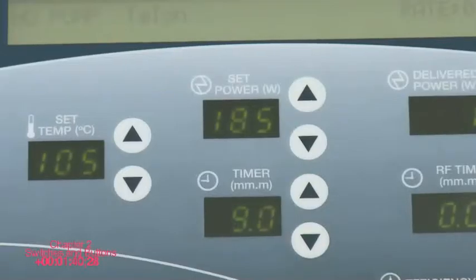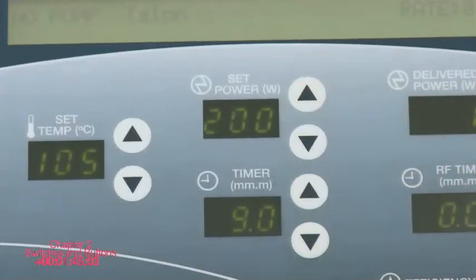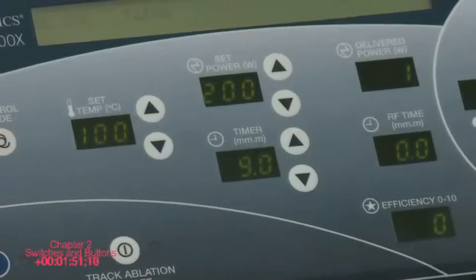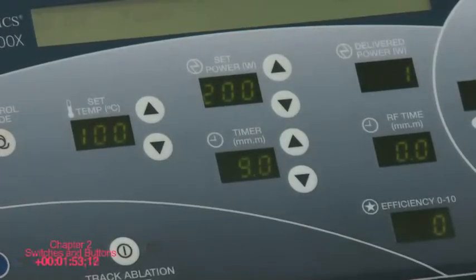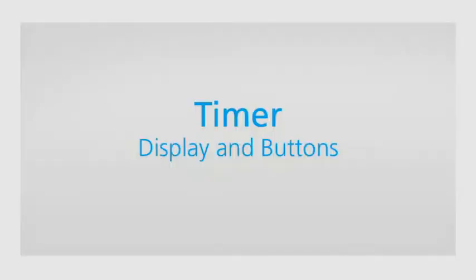Set power watts buttons. Pressing the arrow buttons sets the maximum power in whole units of watts that the system will deliver during the ablation. The power can be increased or decreased. Note, set power as low as possible for intended purposes. Delivered power watts display. Displays the actual power being delivered in whole units of watts.